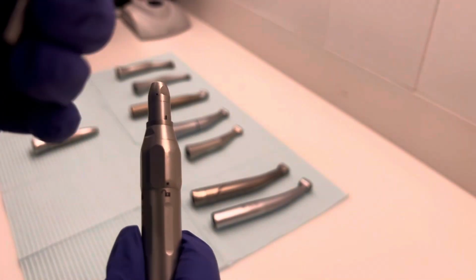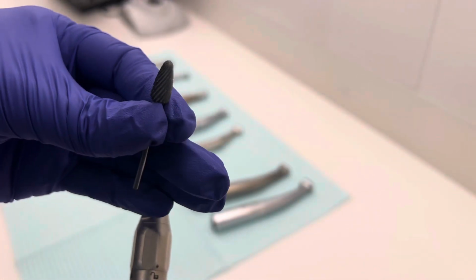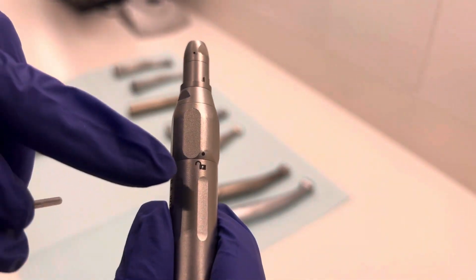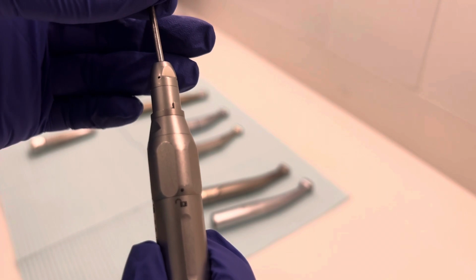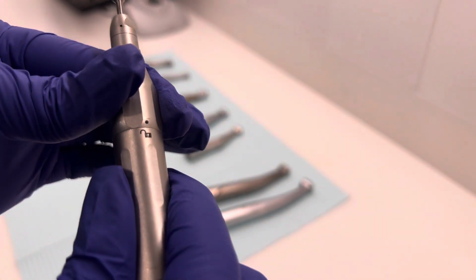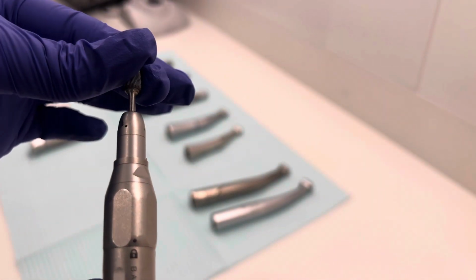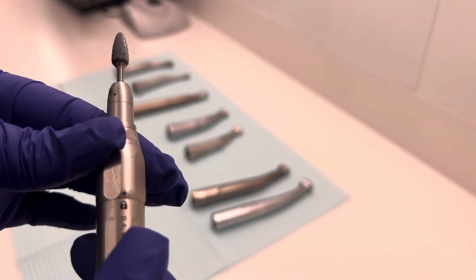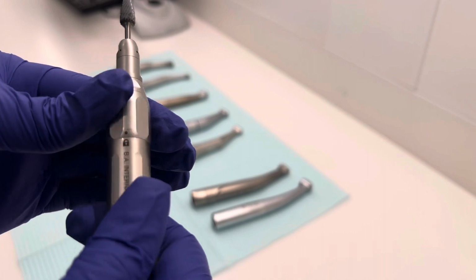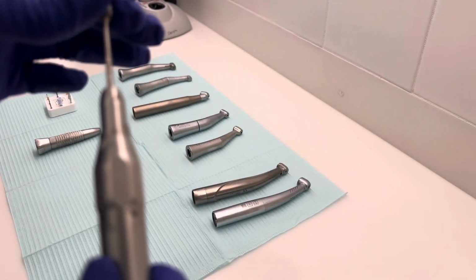So this is usually an acrylic burr that's used in here. It has a long base and a shorter tip. It goes on the top where you use the close and the open dial that I just showed you. Push it in, make sure it's firm, and then close it. That dot should be on the close, so it shouldn't be able to pop out. It should be easy to use. So an acrylic burr is used with a straight hand piece as demonstrated here. And when you're taking it out, you just dial it back to open and slide it out.